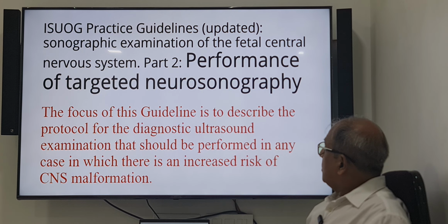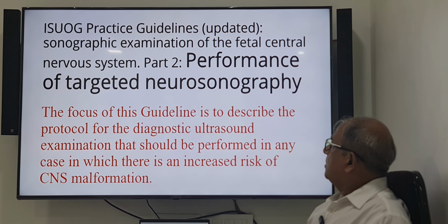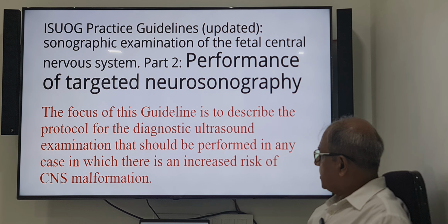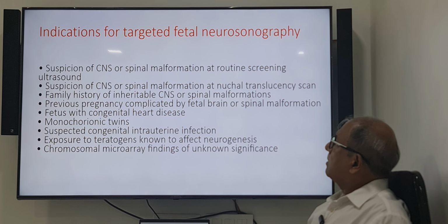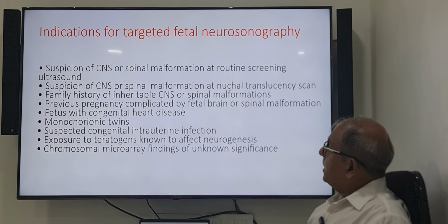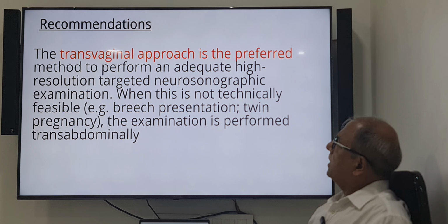What is targeted neurosonography? The focus in this guideline is to describe the protocol for diagnostic ultrasound examination that should be performed in any case in which there is an increased risk of CNS malformation. There are multiple indications, and these have to be kept in mind while we do our screening examination. If there is a problem, we should go for targeted sonography, and the transvaginal approach is the best way.